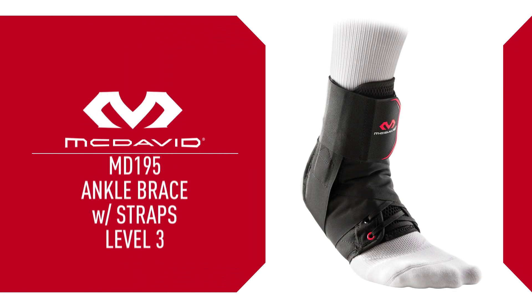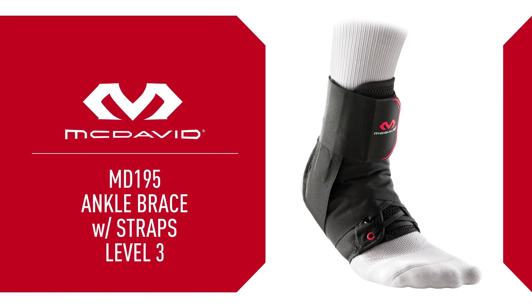This is the legendary McDavid 195 Level 3 Ankle Brace, best for preventing and recovering from common ankle sprains.